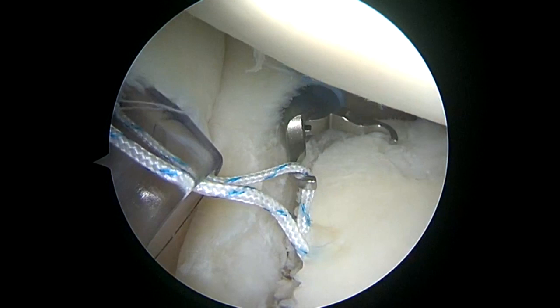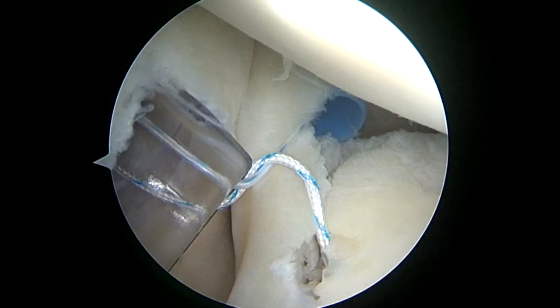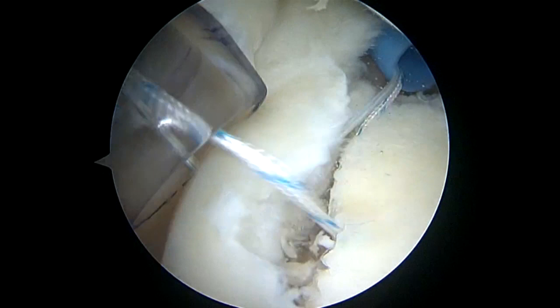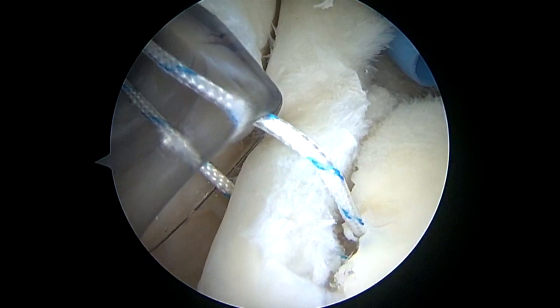I'm viewing from a posterior portal and the loop grasper is in the anterior portal. I'm managing my suture so that I can grab the suture that's closest to the labrum. I'm passing it with an OPDS that's being used as a shuttle, which can be very cost effective in a surgery center.